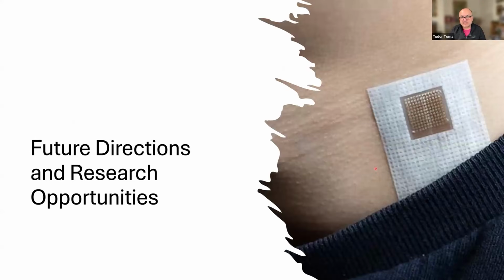Another area which is interesting is the plaster-based ultrasound. And I'll briefly explain why this is possible. The pocket ultrasound that I've shown you at the beginning, the Butterfly system, does not use a piezoelectric crystal. They use a silicon membrane with a matrix of 9,000 tiny little speakers that will generate the ultrasound. And therefore, technologically, it is possible to completely separate this membrane from the bulk of the rest of the electronics of the ultrasound machine.